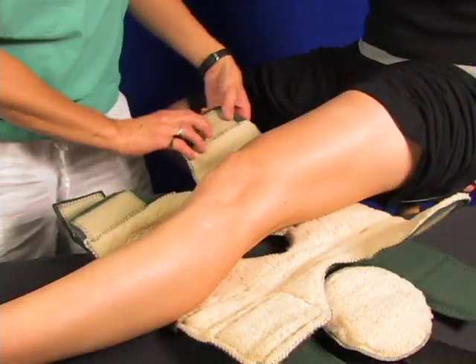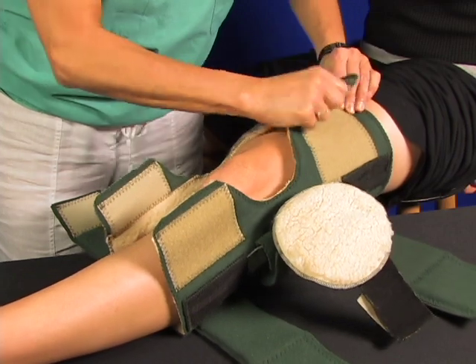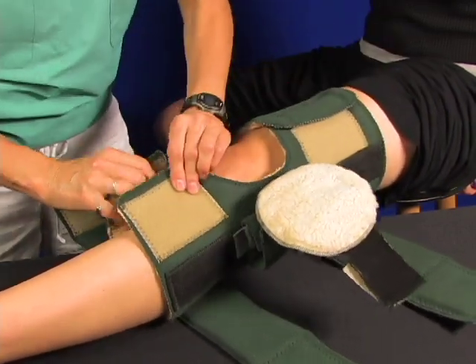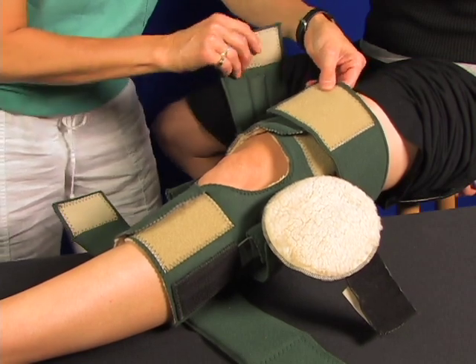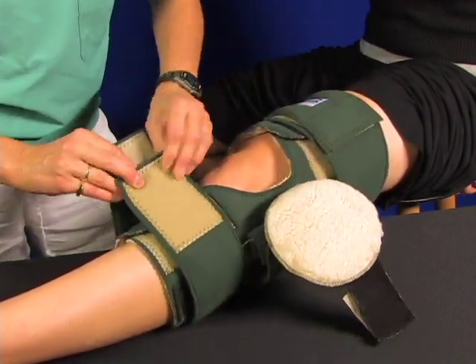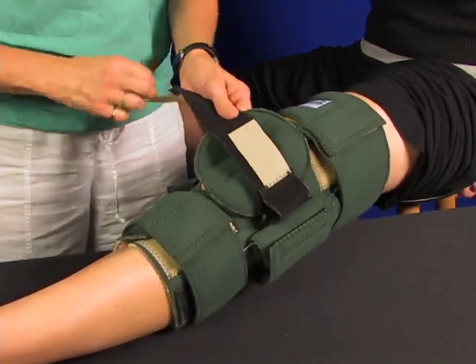the leg. You want to have your hinges set pretty much to where you're going to end up prior to application. You do a preliminary fit here with the liner cover straps, and then the outer straps reinforce that, keep the knee properly tensioned and in place.